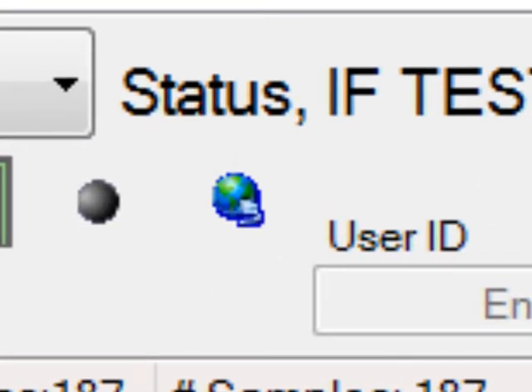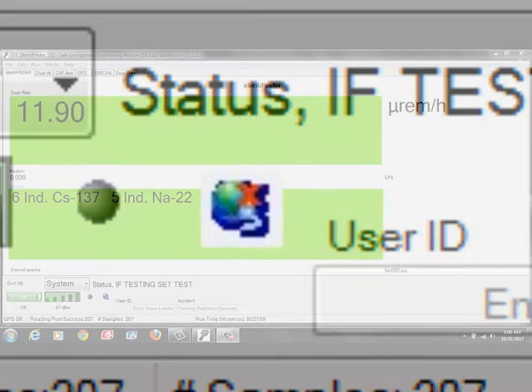The connection indication is a communications globe that has three states: connected, wherein a wireless connection is established with the meter; broken, which includes the addition of a question mark indicating the wireless link with the meter is broken and the application is attempting to reestablish a connection; disconnected, which includes the addition of an X indicating the network connection is disconnected.